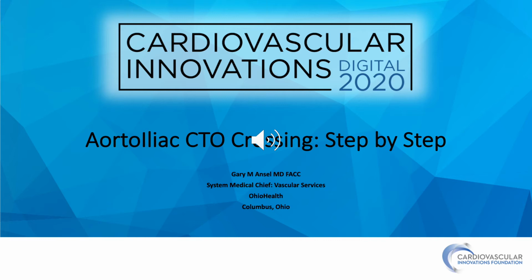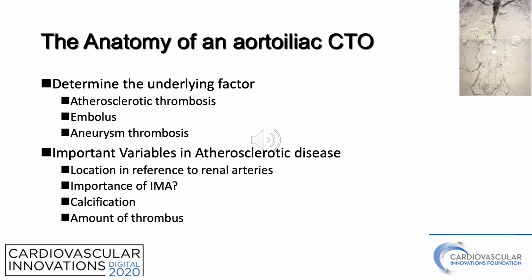I'm Dr. Gary Ansel, and for these case-based discussions, I'll be talking about aortoiliac CTO crossing: a step-by-step approach. Let's start with looking at the anatomy of an aortoiliac CTO.